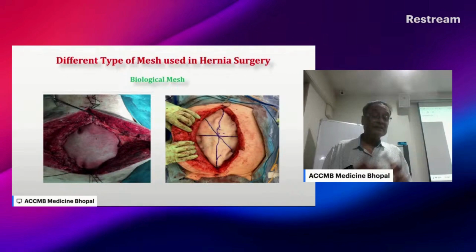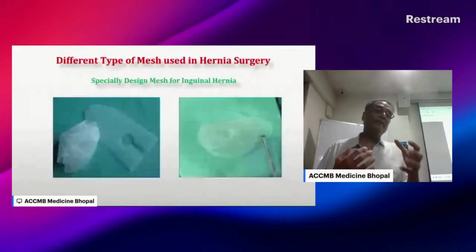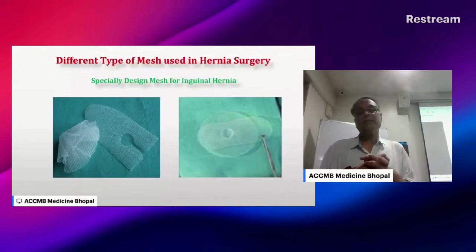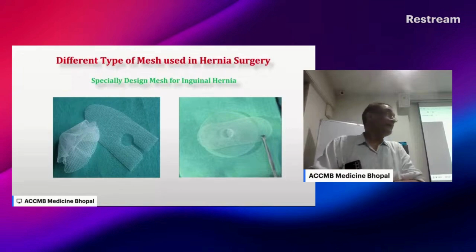Nowadays we are having 3D print technology, and soon we are going to have another form of inguinal hernia repair, with a different 3D printed technology of this type of meshes. So we are having a plug type of method. These are basically pre-formed inguinal hernia meshes.